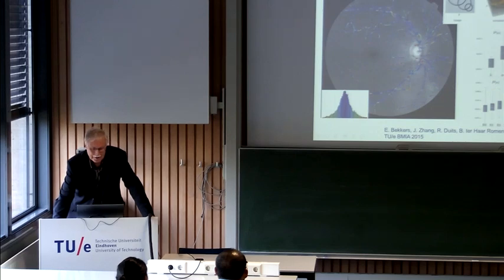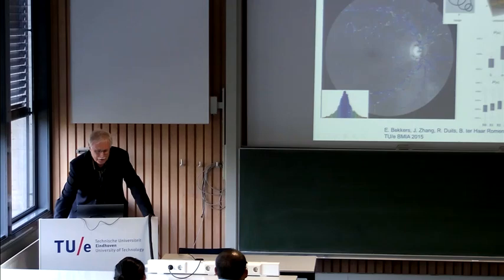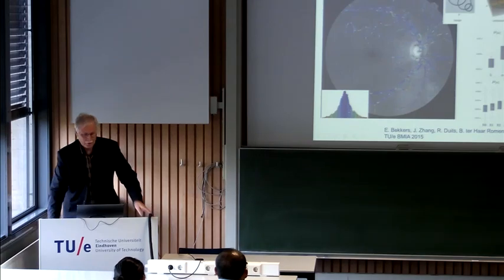It turns out to be a very stable way of measuring the radius of the circle that fits. And you have here all the measures color-coded. So you see that blue is 0, red is very high curvature, and yellow is very high curvature the other way around. And if you measure the straight vessels, then all curvatures are 0.